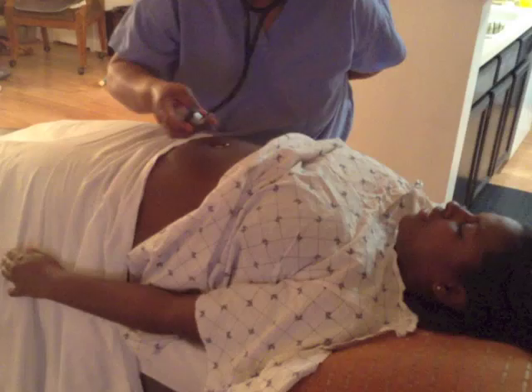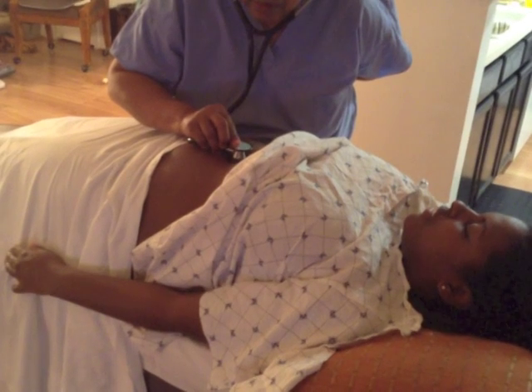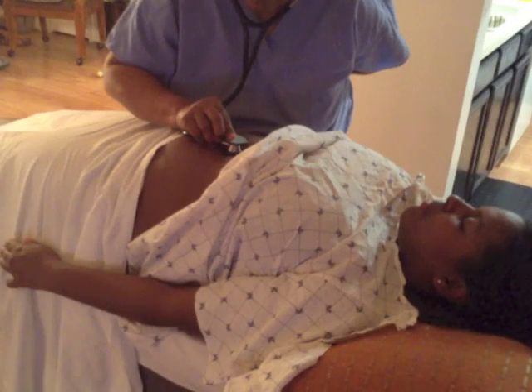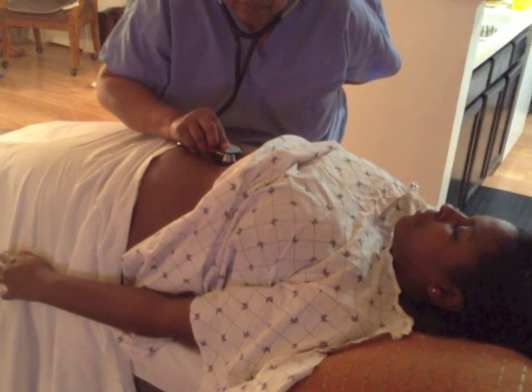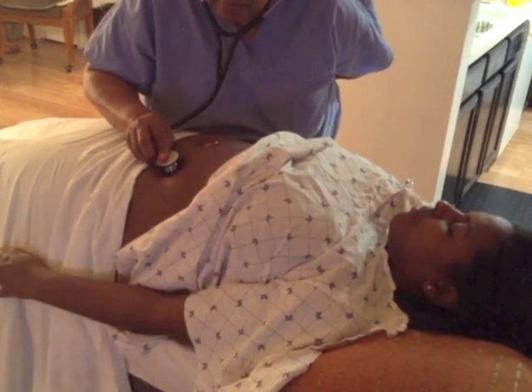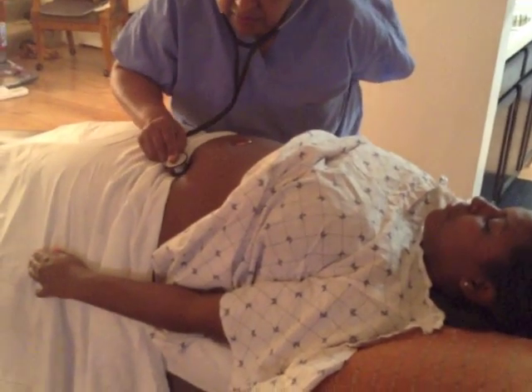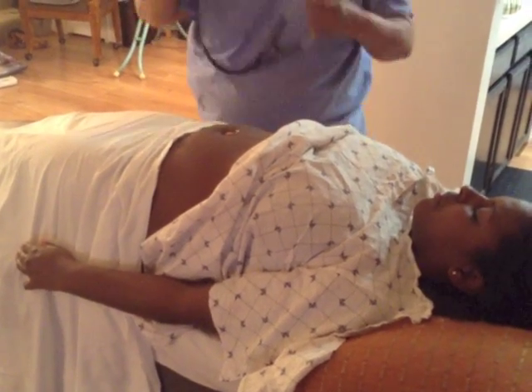I'm going to listen to your aorta, renal artery, iliac artery on both sides of it, the femoral artery. Your bruit seems to be very normal.